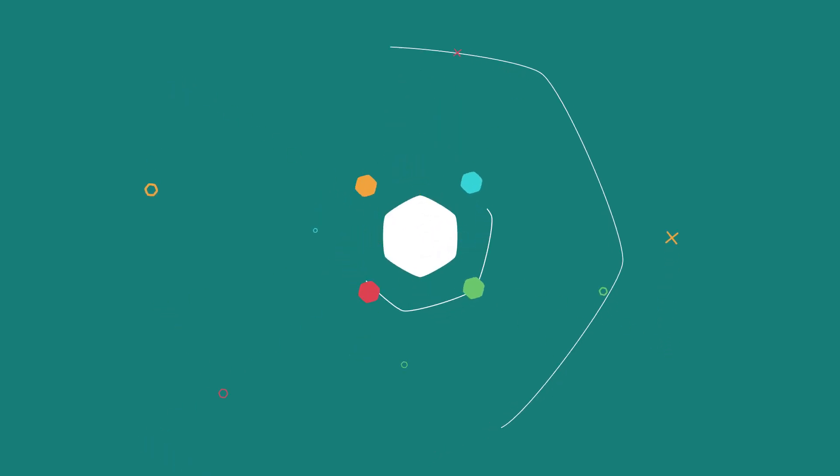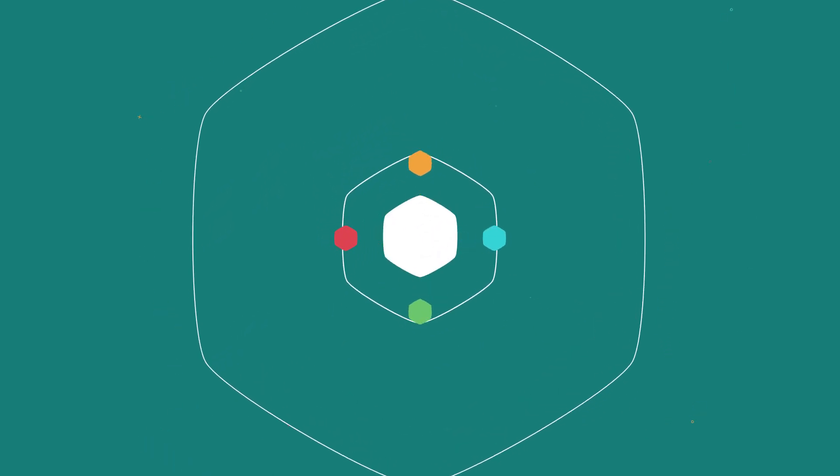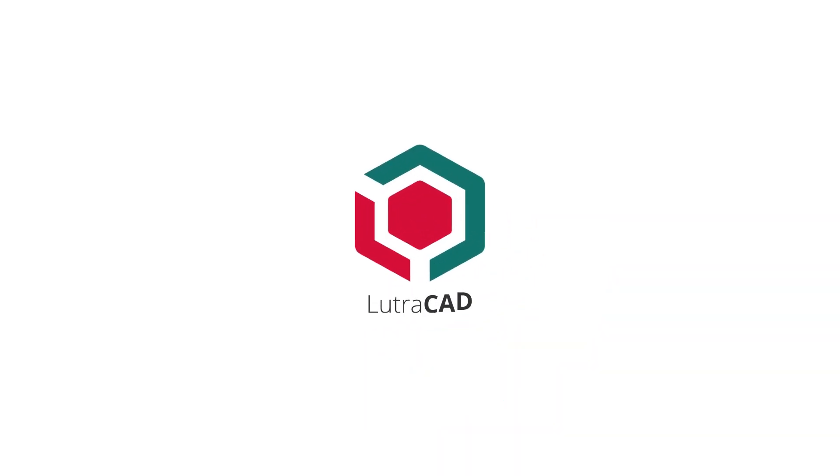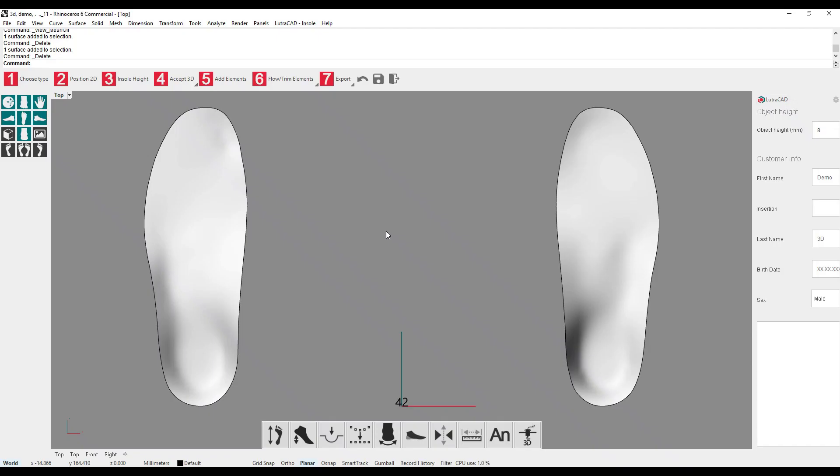Welcome to the introduction videos of LutraCAD. This is a video about how to move, zoom, and pan around in LutraCAD.